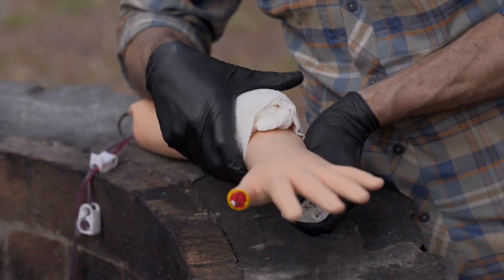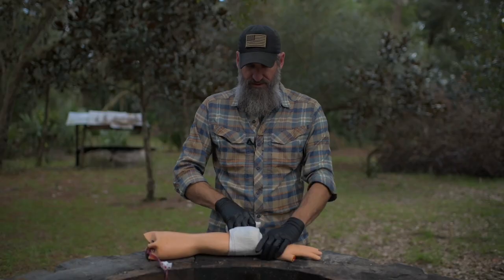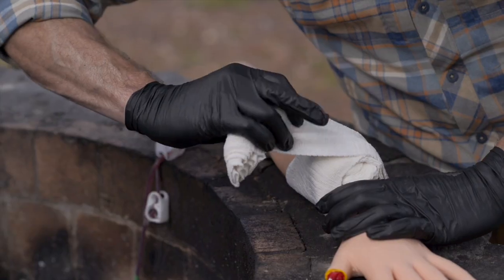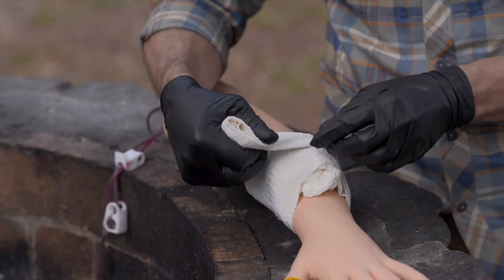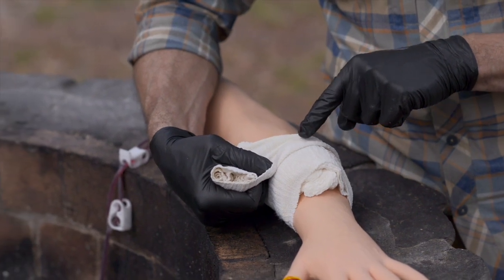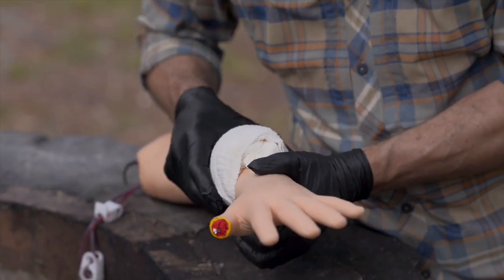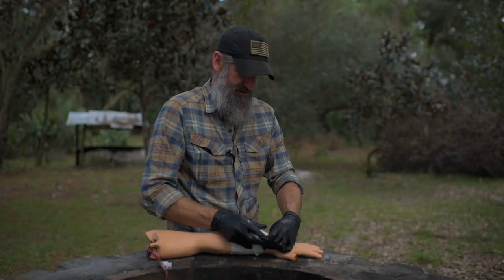Then as I come over, what you'll do with this one, because you don't have that pressure bar, is come directly over top of the wound, and you're going to twist the dressing to kind of create that hourglass shape, and that fold goes directly over the wound. And pull tight. Cover up your edges just like you did before.